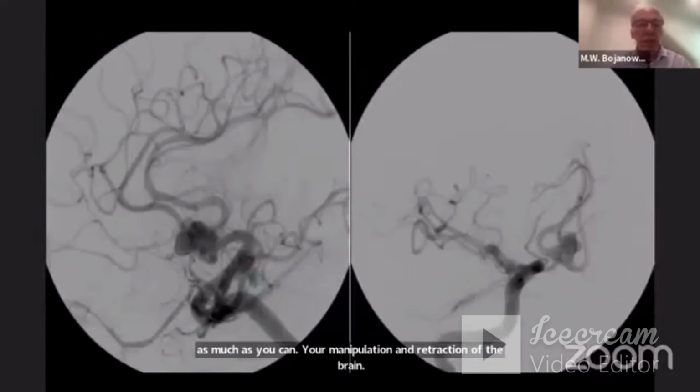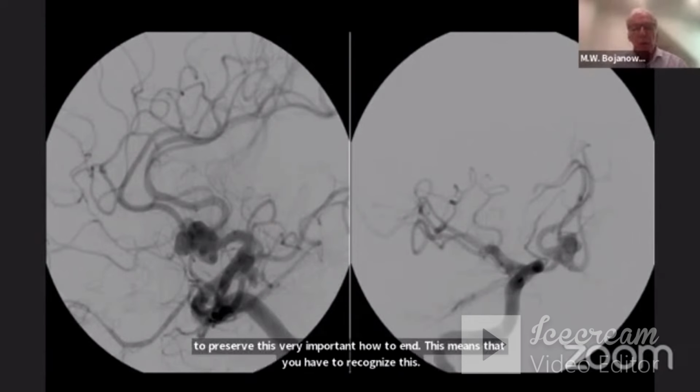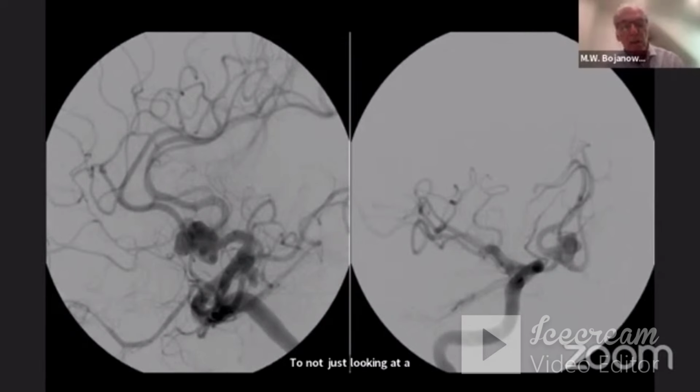So this is an example of a patient with the median artery of the corpus callosum. This is a ruptured aneurysm, and you can see how important it is to preserve this very important artery. And this means that you have to recognize this artery, not just looking at both A2 on each side, but also finding the median artery of the corpus callosum, even if it is hidden by the blood.